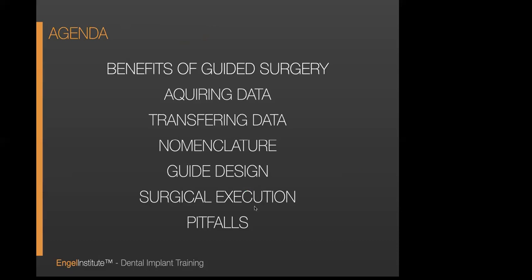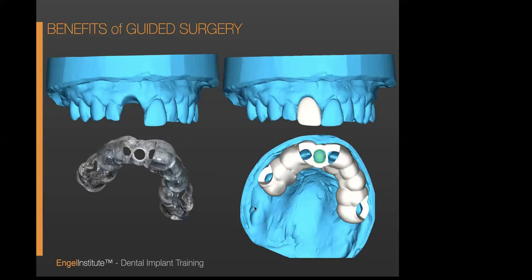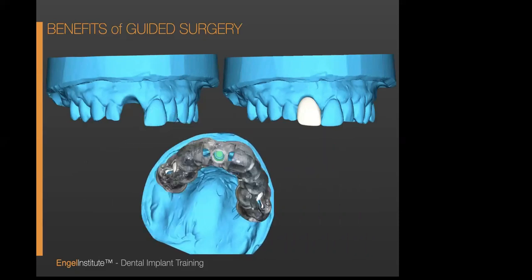All right, let's get into the benefits of guided surgery. And there are several. I'm just going to give you a couple. We have obviously the accuracy. And you're going to notice that everything is asterisks, and there's a reason. Predictability, certainly.